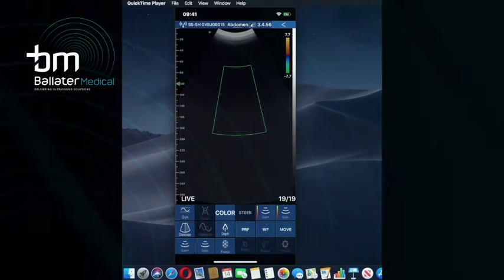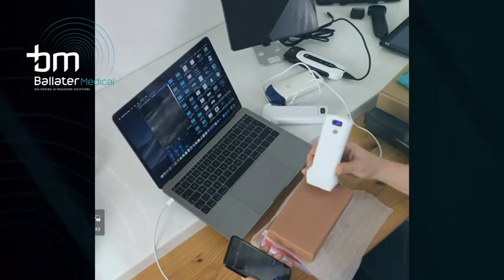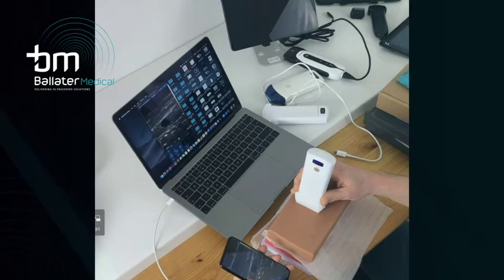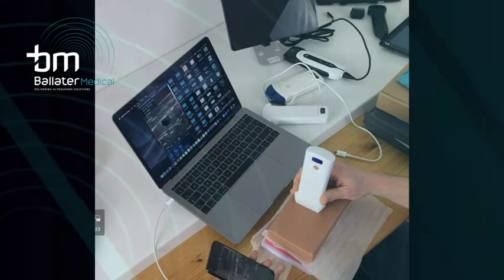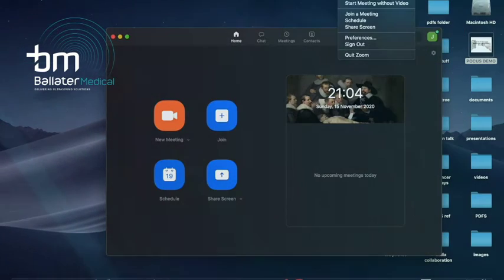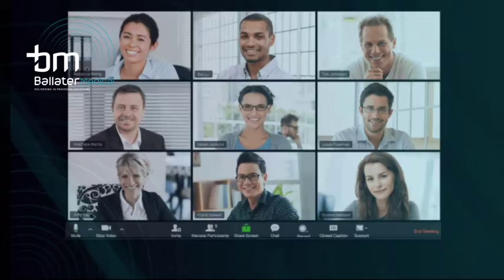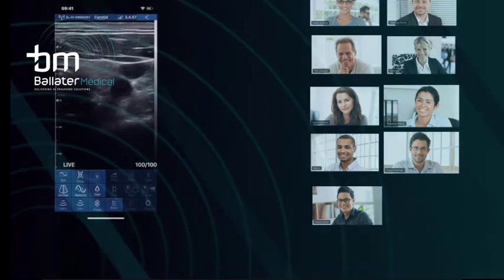This is an example of just using a simple phantom to scan an image, and it serves as a useful introduction to students on the basic functionality around the probe and acquiring simple images, adjusting frequency settings, depth settings, and making simple measurements. So set up whatever demonstration you're going to give, and go into your meetings platform. We've chosen Zoom here as an example. Enter and set up your meeting, and then simply give the relative permissions for the users to use screen sharing, and you're now in a virtual classroom environment where you're able to give your instructions, your lecture portion of your class, along with practical demonstration of how to acquire ultrasound scans.